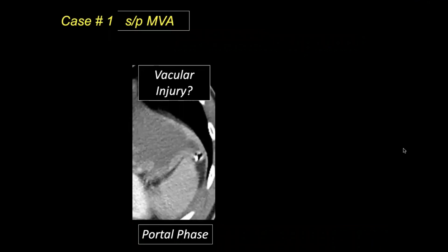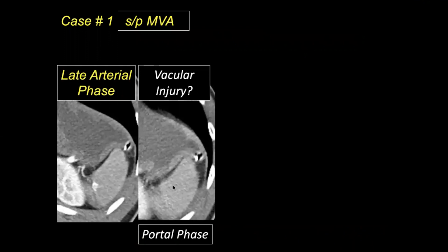Let's look at a couple of examples. On this case of MVA, the portal phase demonstrated a small amount of perisplenic fluid, slight irregularity of the parenchyma, and no obvious active bleeding. However, on the late arterial phase, note a small pseudoaneurysm that becomes isoattenuating on the portal phase and therefore invisible. This patient was treated with embolization.